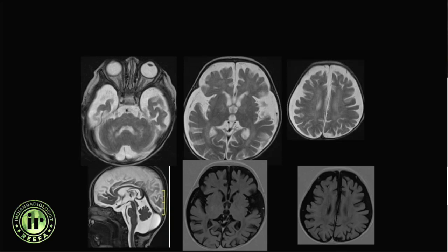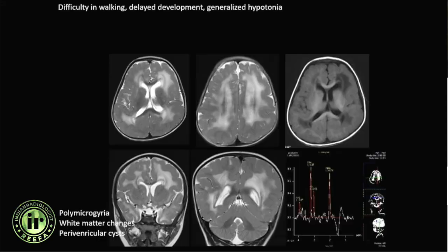In another case, the sylvian fissures are wide open and there is signal abnormality seen in the dentate nuclei. The diagnosis here is glutaric aciduria type 1.